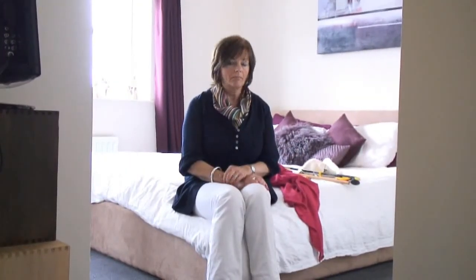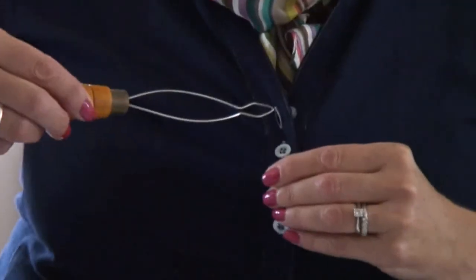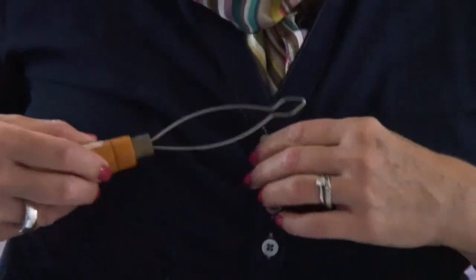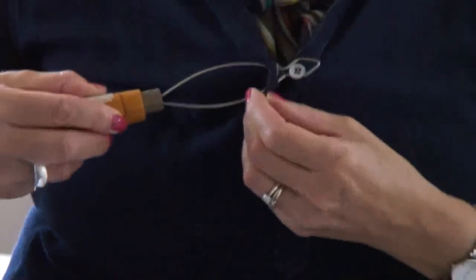Another area of difficulty that people often have, particularly if they've got limited movement in their hands or they've got arthritis, can be doing buttons — small fiddly items. A simple piece of equipment which can help with that is an item called a button hook, a little bit like a crochet hook really. The idea is that it pops through the button hole, you catch the button and pull it through. And equally, it can be used for undoing the button — it's just the reverse of the procedure, catching the button and popping it through the hole.